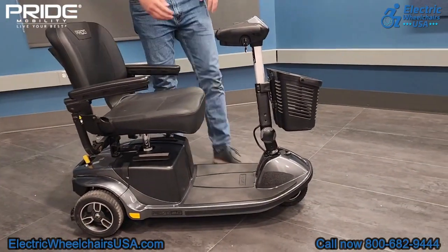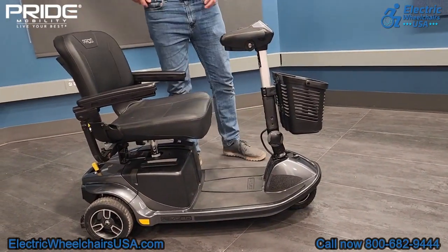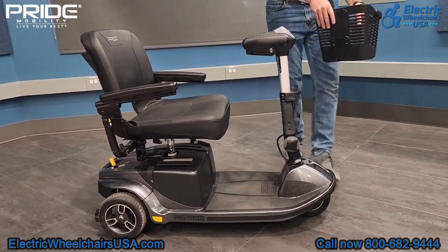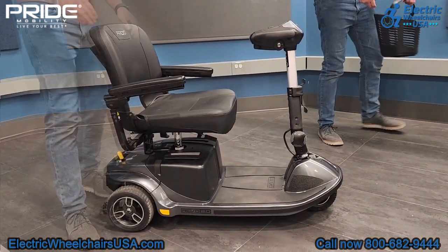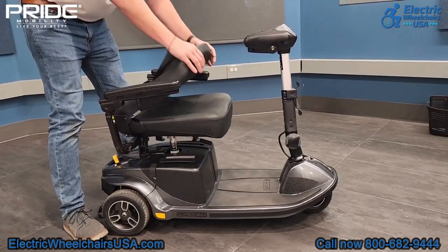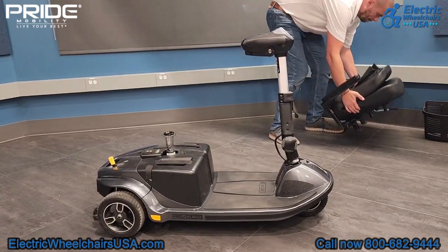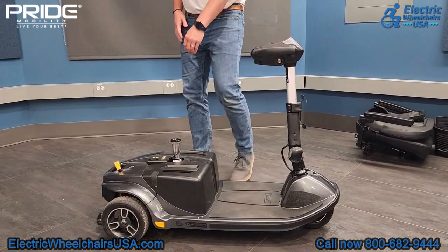So the first thing you do is you want to take out the key. Make sure you put that in your pocket. Next step is you just pop off the front basket, and it even has a handle so you can take it with you if you wanted to go shopping. After that, just fold the seat back down and pull straight up, and the seat will come right off of the seat post. After that, you would remove the battery.